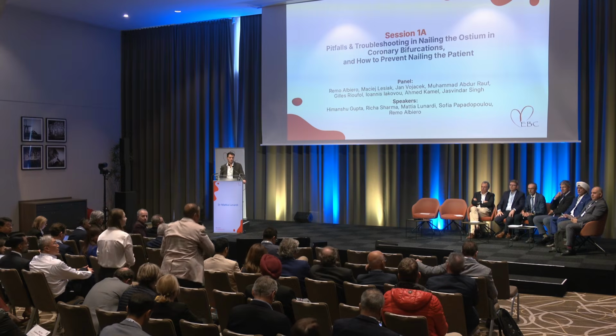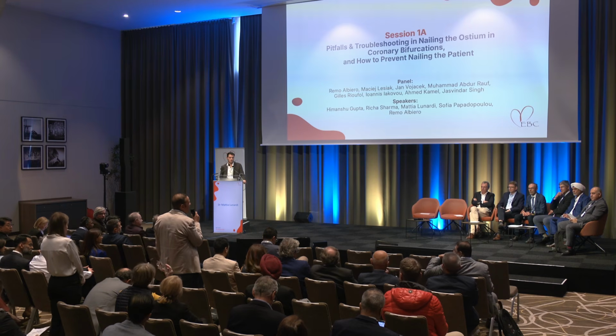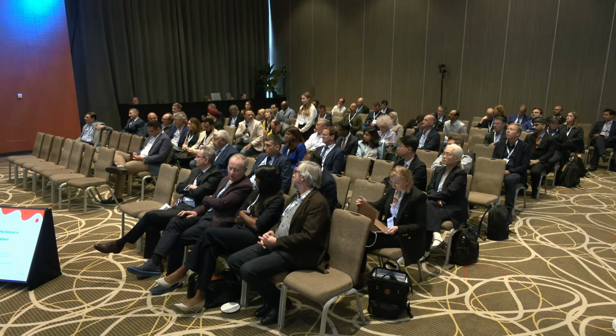Yeah. And people, go ahead. I think in isolated ostial circumflex, in the era of DCB, we can use DCB only for isolated circumflex and bail-out stenting if you have recoil or dissection. So what's your opinion about that? Yes, now it's an evaluation, but this is good, because the circumflex is considered the side branch. But there are no results about these modalities. Anecdotally, we do a DCB in ostial.